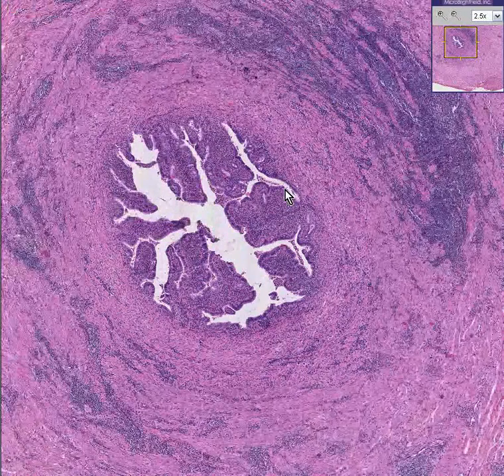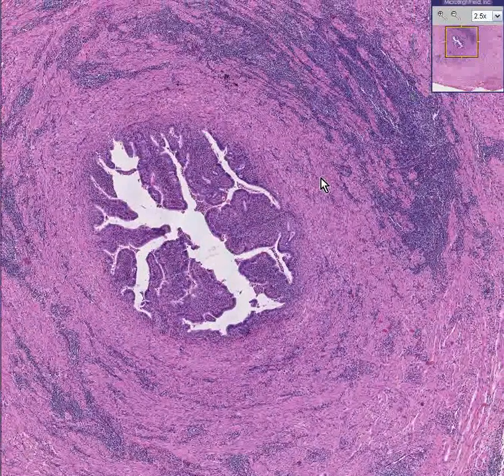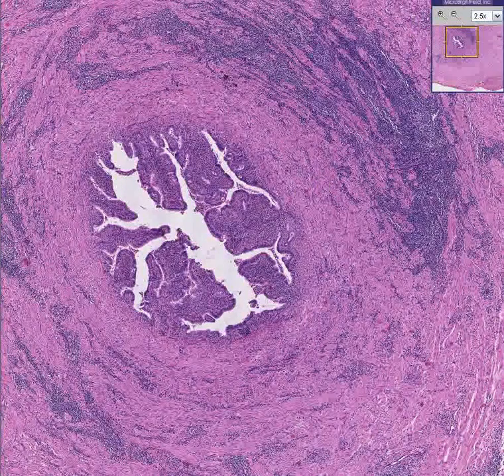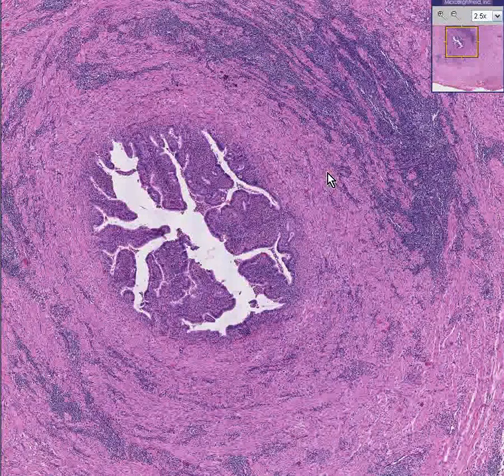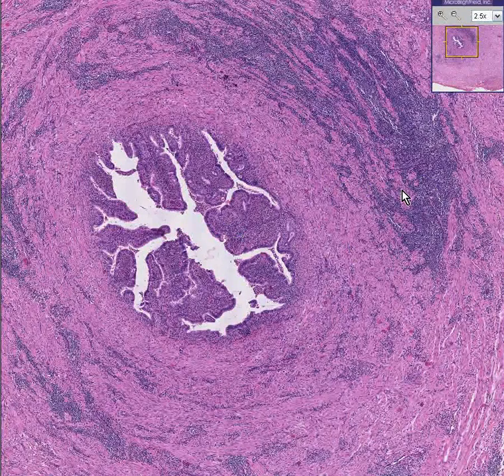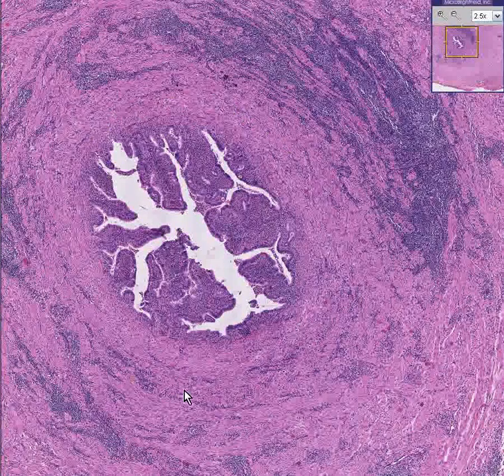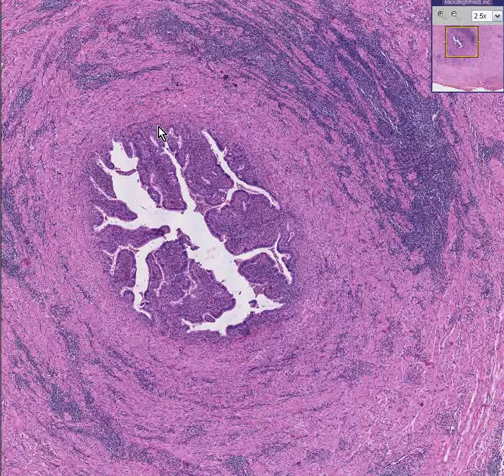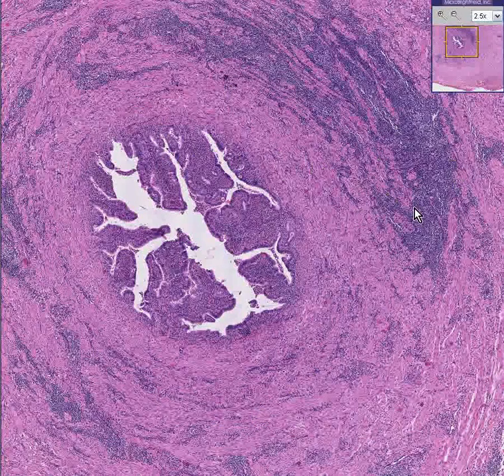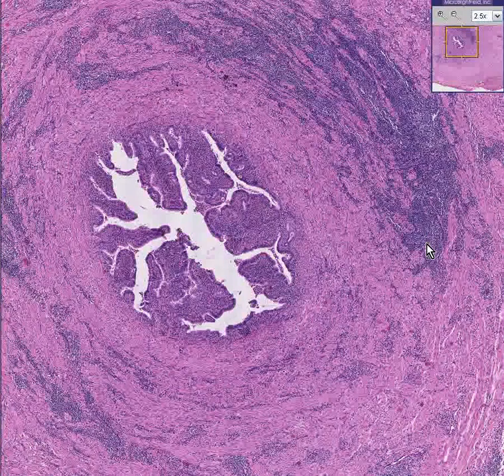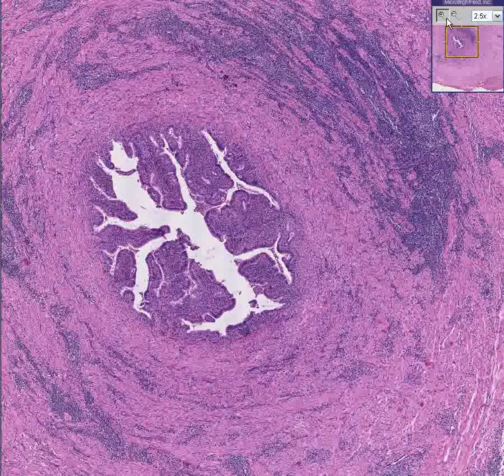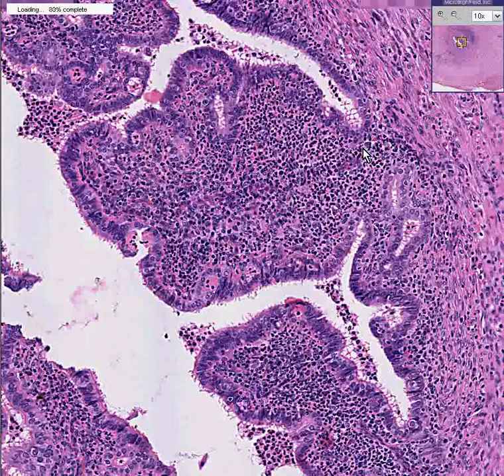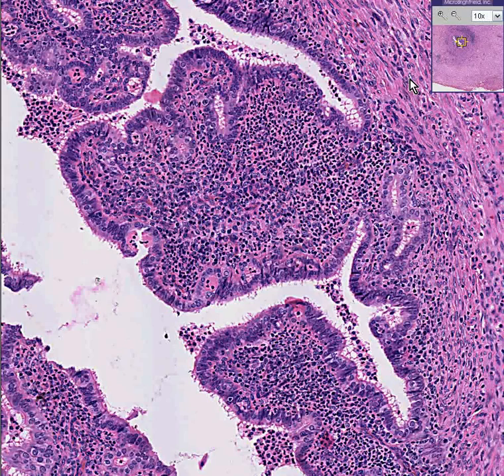I like this case because it's once again a classic example of how you take the normal histology of an organ, add in chronic inflammatory cells, and you have the diagnosis. Here's a salpinx that, if it didn't have all these lymphocytes, you would just call a normal fallopian tube. Throw in some chronic inflammatory cells and you have chronic salpingitis. If these were primarily acute inflammatory cells or neutrophils, you could call it acute salpingitis.